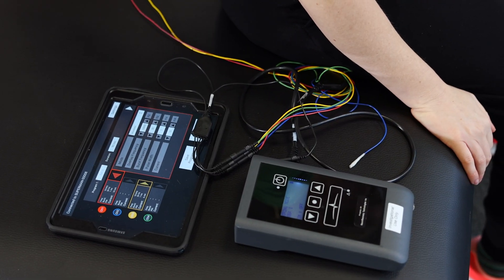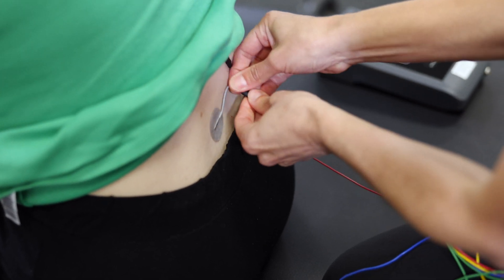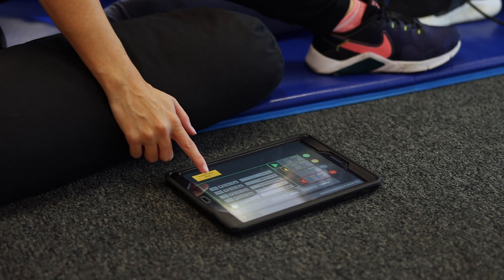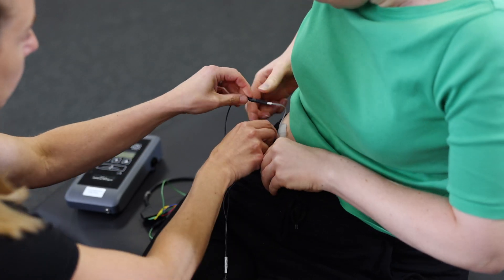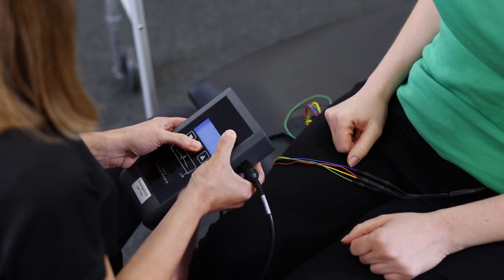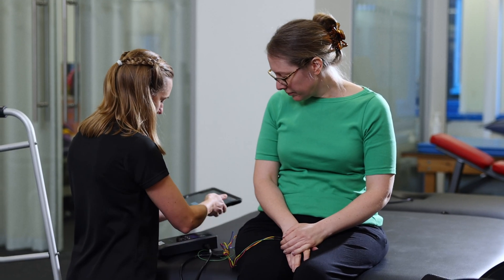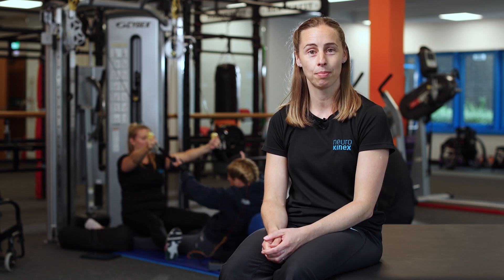The entire system can be programmed by a physical therapist or clinician using a tablet like an iPad, and we're also hopeful that the client — the person with spinal cord injury — can also control the device via voice command with a smartwatch or a smartphone. The transcutaneous spinal cord stimulation works by applying electrodes to the surface of the skin, which sends electrical currents through to the spinal cord, which excites spinal circuits.